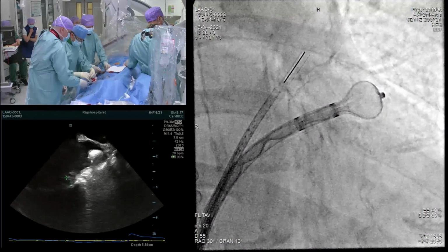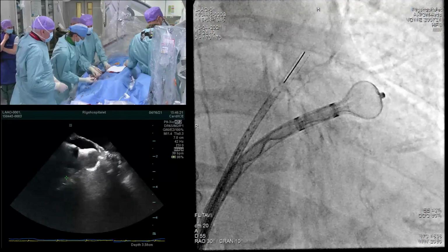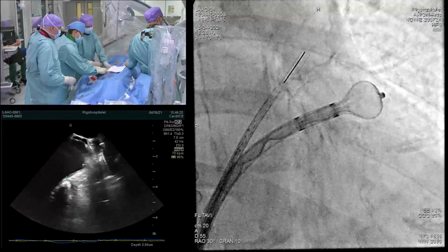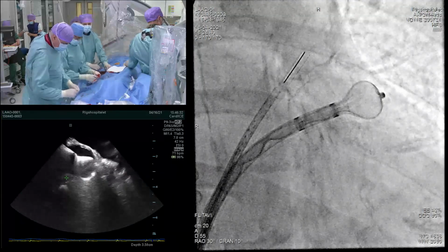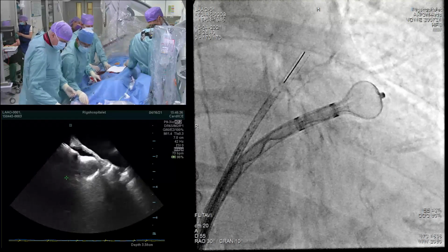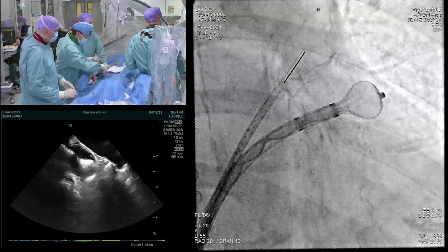Reconnect here. Yeah, okay, that's a good solution. There we go. In that in-between piece. Oh yeah, can we have that? Where do we have that? So it's just a matter of finding the connective part again. Where did you put it? Here. Yeah.